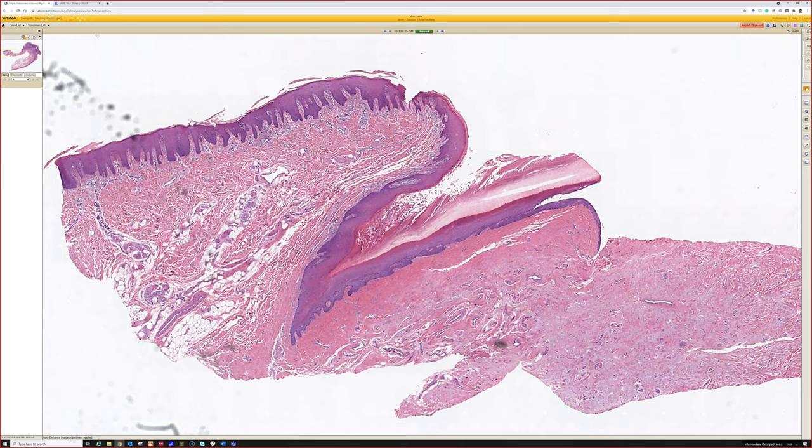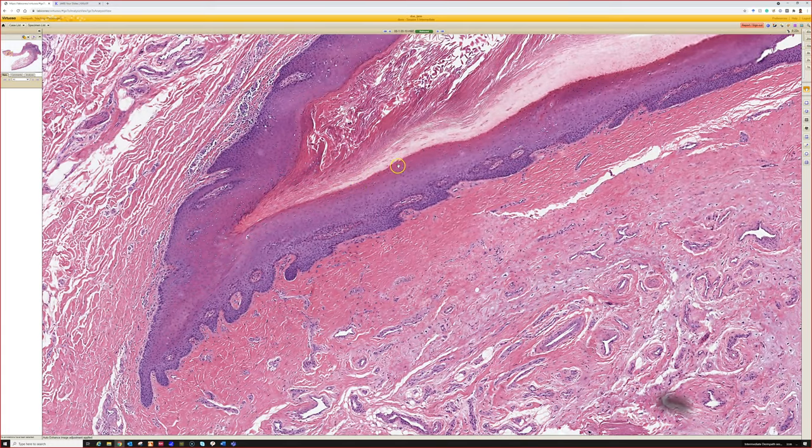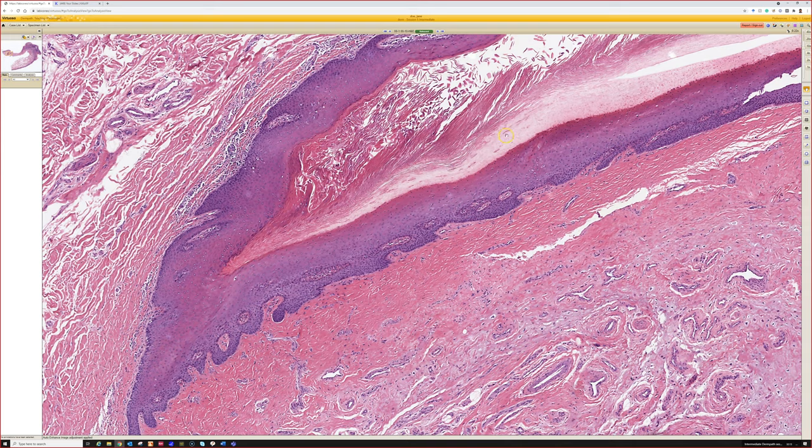Very good. This is the nail matrix. So this is not a small biopsy. This is a fingertip, basically, or a thumb tip or a toe tip. I don't know the history of this case. But yeah, this is the proximal nail fold. And then here's where it curves under and goes down. And then this little jagged area here is the nail matrix. We'll stop and admire for a minute the beauty of this normal histology, because we rarely, thankfully, get to see full, nice orientation of this kind of specimen.